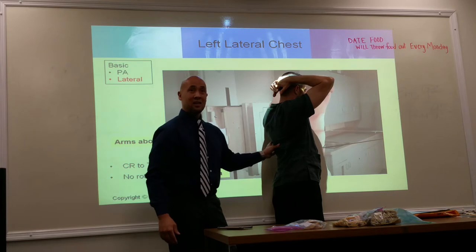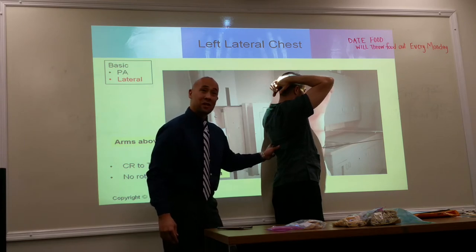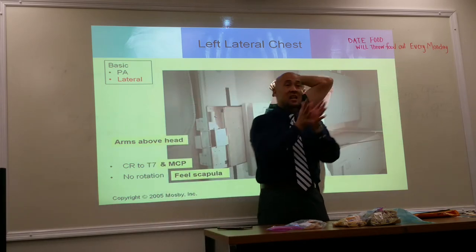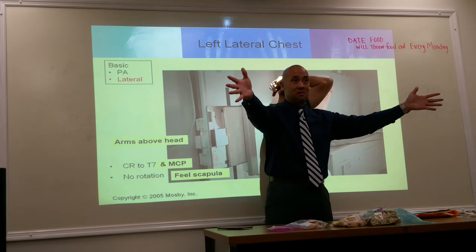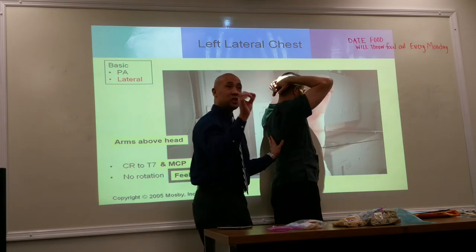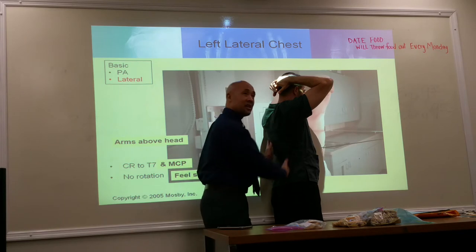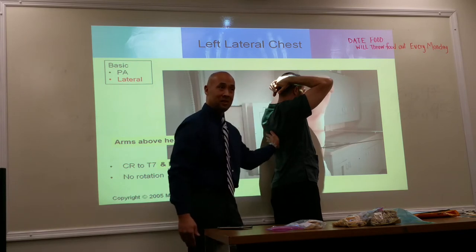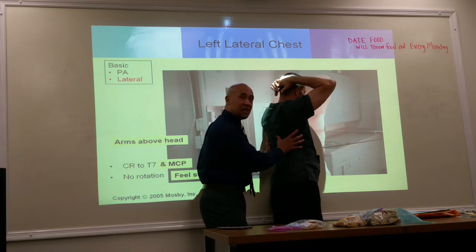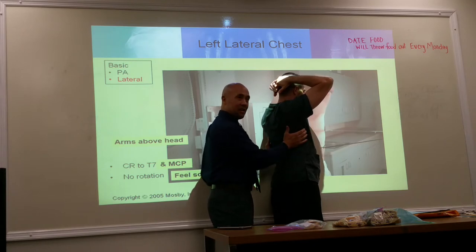You guys know why I did that? Remember the divergent beam? It doesn't only diverge this way, it diverges this way. So the purpose of rotating him slightly is to make sure that I've got one set of posterior ribs. The rotation of his body is matching the divergence of the beam. Okay? It's all because of this right side.